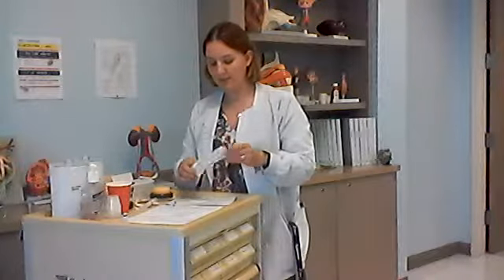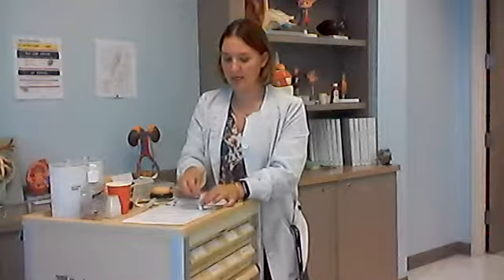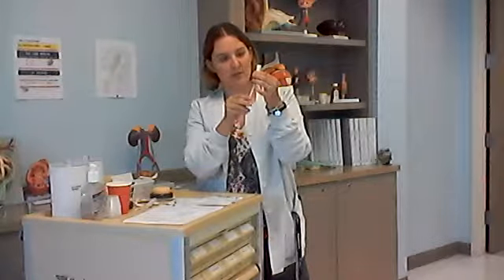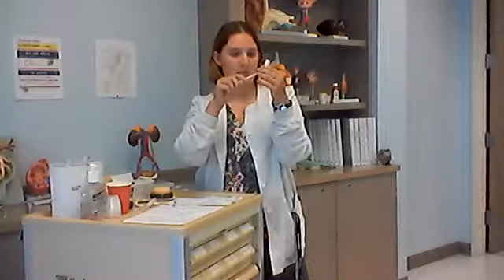Last but not least, we're going to prepare our tuberculin. Okay, I know I need 0.1, so I'll pull that down, clean the top of our vial, inject the air in, and draw out the 0.1 milliliters.